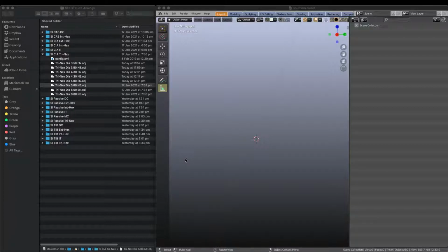Some other CAD programs work this slightly different. So I will show you how this works, and in so doing we will be able to get these analogs compatible with Blenderfordental. On the left hand side I've already started my work here. All of my folders, each folder carries the name of the actual part name. So I've converted all of these into OBJ, and in so doing I have radically downscaled the whole library. Within each one of those there are 3 STLs.